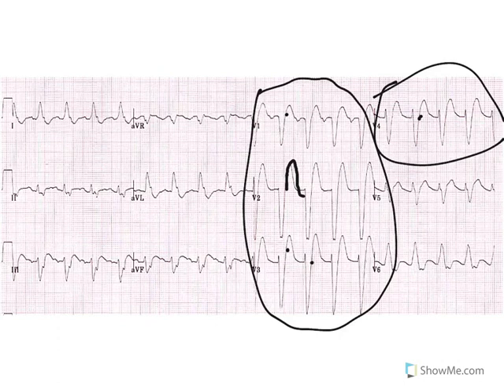All right? And so what you're seeing here is this massive T wave now coming after that QRS, right? And remember when I said you have weird depolarization in a QRS, you're going to have weird repolarization in your T wave. Okay, so that's normal. That's normal to see.